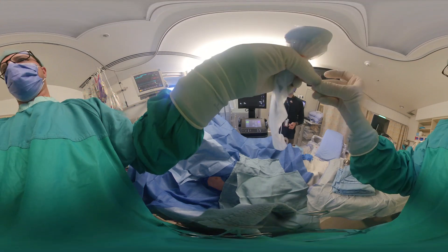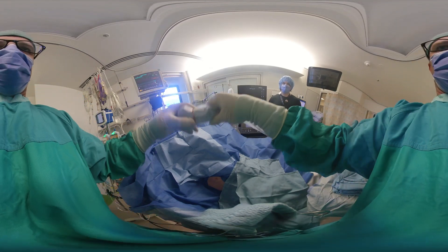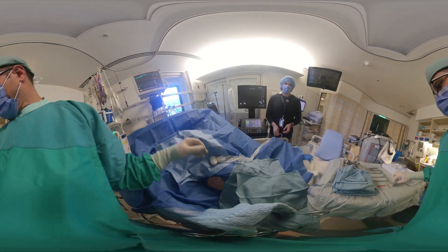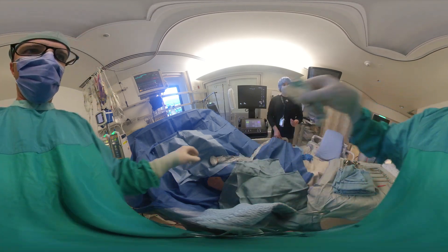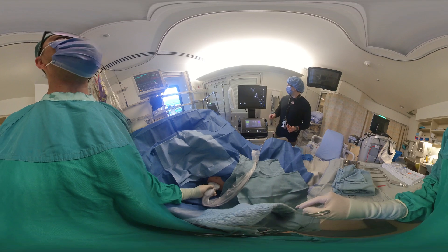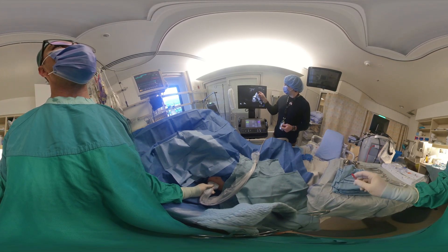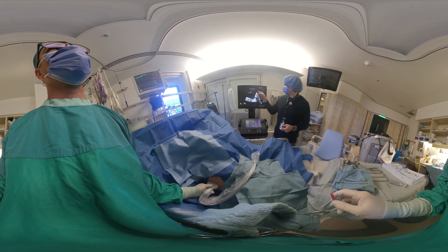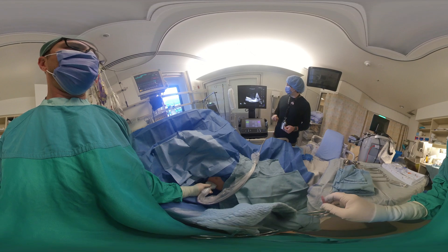I generally prepare the ultrasound probe in this kind of procedure because it really helps to make sure you're in the correct place. What we're going to do is landmark the site in advance with ultrasound to make sure we're above the diaphragm. You can see the semi-lunar shape, the spine sign, and the nice anechoic field — this confirms we are indeed in a safe place, well above the diaphragm.